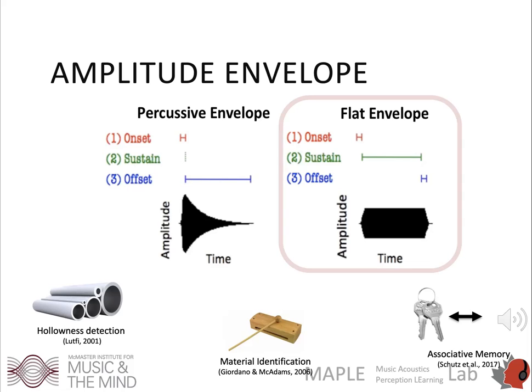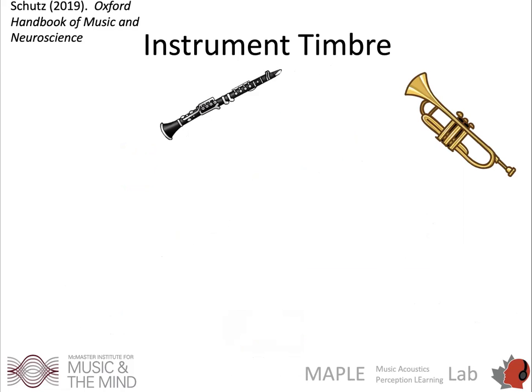The reason that's particularly important is that when we apply that to the context of auditory alarms, we're in a situation where not only do we need to hear a lot of sounds, but also remember what they are associated with. Now, the next step in how we're going to design the stimuli comes from some of our experience and interest in music, so I just wanted to briefly talk about musical timbre.